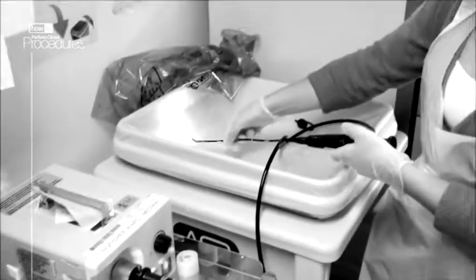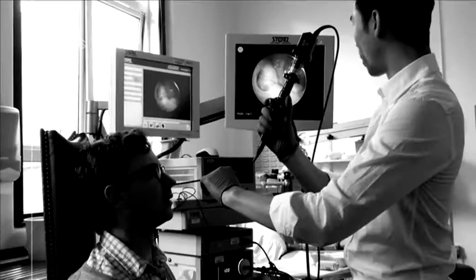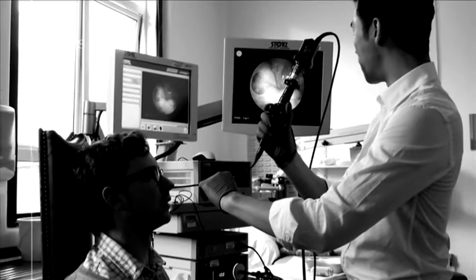In this video the equipment will first be demonstrated. The procedure is then performed on a patient with the scope connected to a monitor.